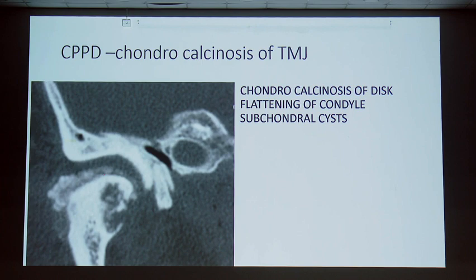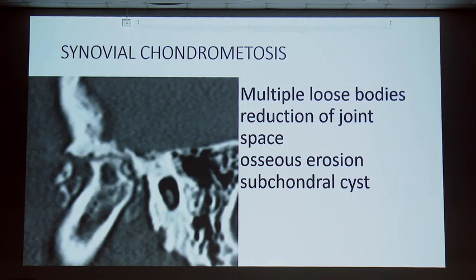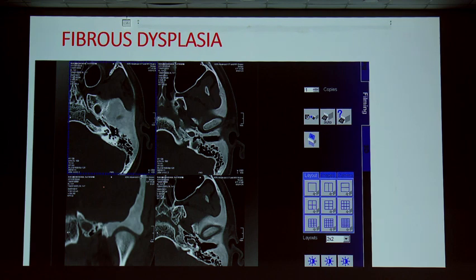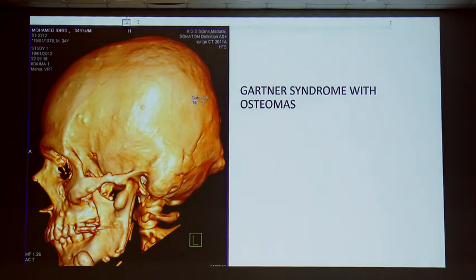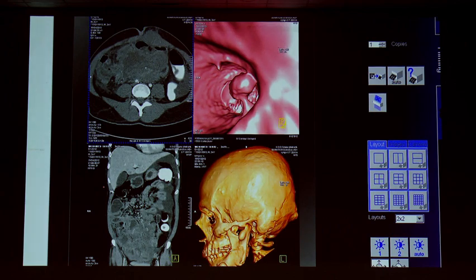CPPD can occur due to chondrocalcinosis — the disc becomes calcified, with erosions also present. This is classic chondrocalcinosis; just like knee cartilages, TM joint disc cartilage can calcify. Synovial chondromatosis with multiple loose bodies can also be seen. Tumor and tumor-like conditions: fibrous dysplasia can occur in the condyle. Multiple osteomas are commonly seen with Gardner syndrome — skull osteomas, mandible osteomas, condylar process osteomas — along with desmoid tumors, multiple lipomas, and colon polyps, all features of Gardner syndrome.